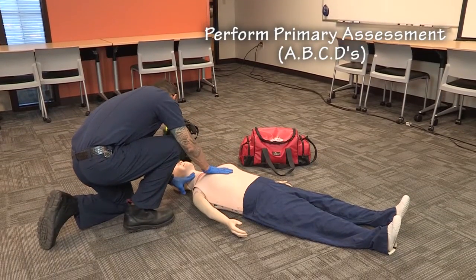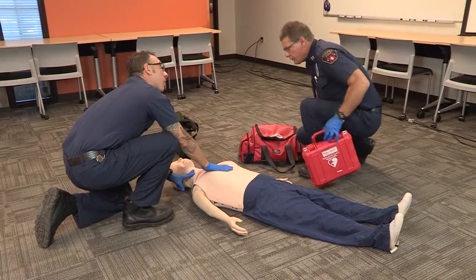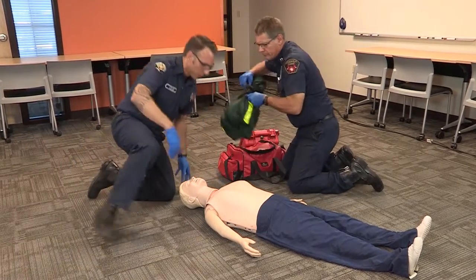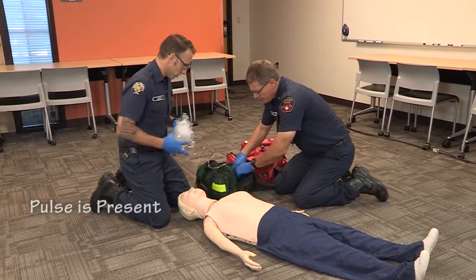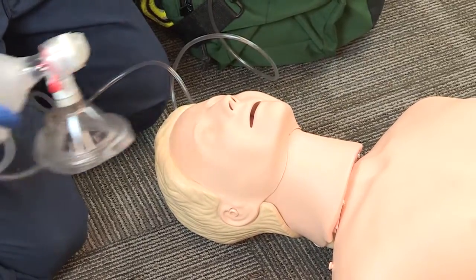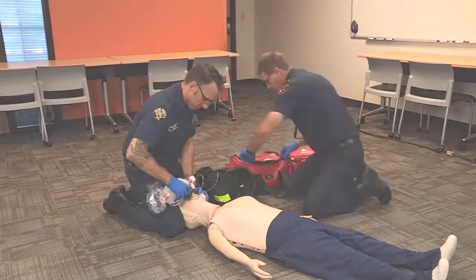The first thing you want to do is establish unresponsiveness and check the patient's ABCs. The roommate strongly suspects the patient may have overdosed on his pain medication today. We have a good pulse, but he's barely breathing. Once you've determined that the patient has a pulse and that their respiratory rate is less than 8, your focus now should be managing the patient's airway, to include assisting the ventilations with a bag valve mask.